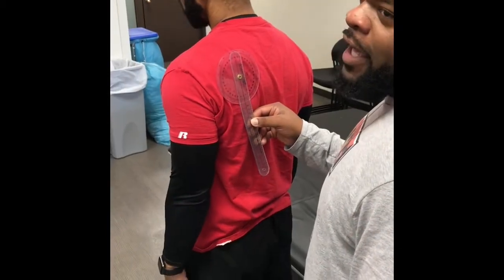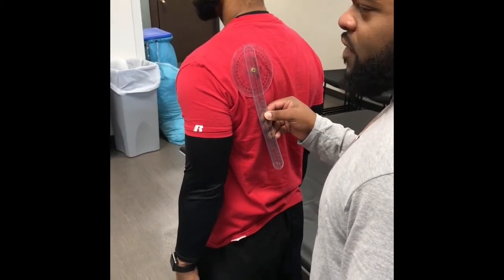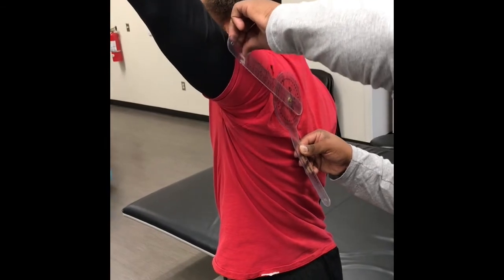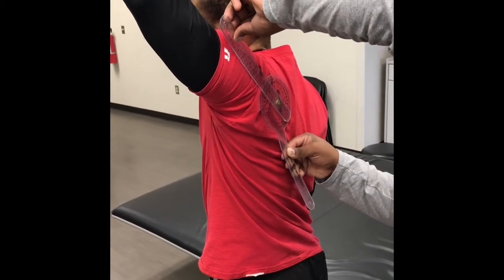Now we're going to do shoulder abduction, and the normal range for this is 0 to 170, so if you would please sir, bring your arm out like that. And he is at 135.